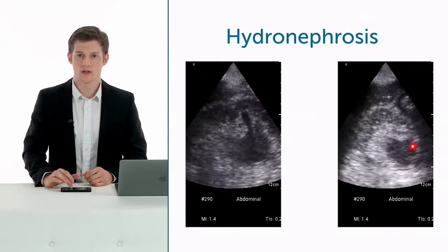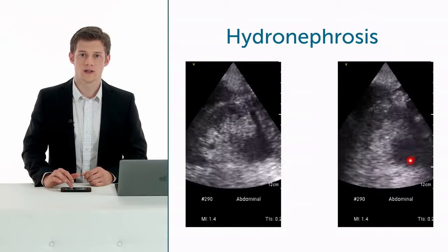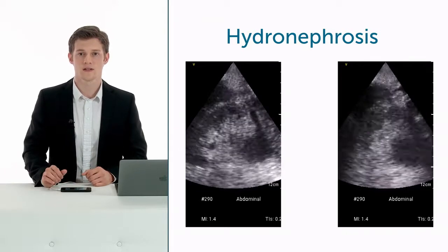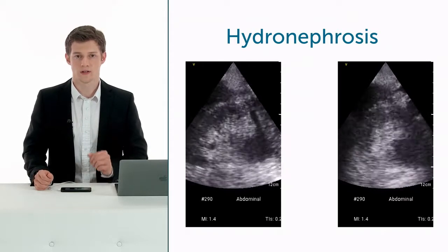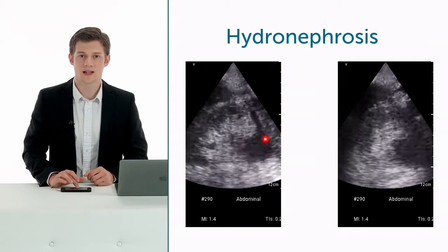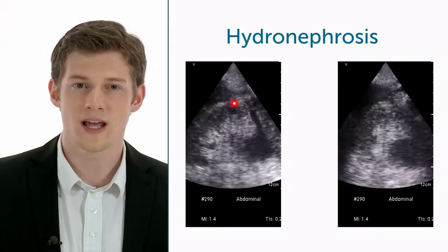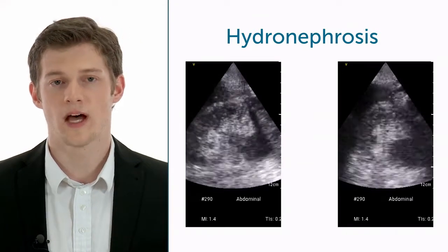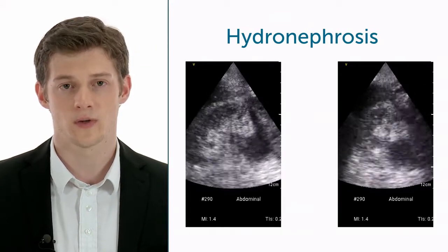Here is the transverse view of the kidney. Here you see dilated renal pelvis and renal calyces. I would have said grade 2 hydronephrosis. But if you take a look at this longitudinal view, you see again the dilatation of the renal pelvis and the calyces, but also a narrowing of the renal parenchyma. This is grade 2 to 3 hydronephrosis. I graded it like that and described the renal parenchyma.